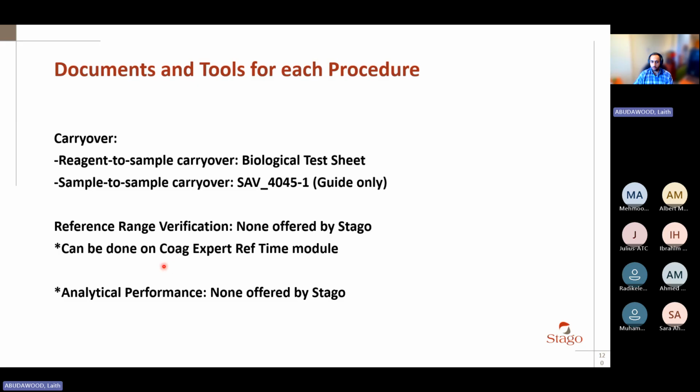It's really very good. So you can do, Ibrahim, if you remember what you were asking me, if you have historical data that you can use, COAG Expert can do that for you and filters things very well. The only missing part is you do not have the patient information. You must bring that from the LIS that the patients do not have any pathologies, because often the LIS does not send this information to data managers.